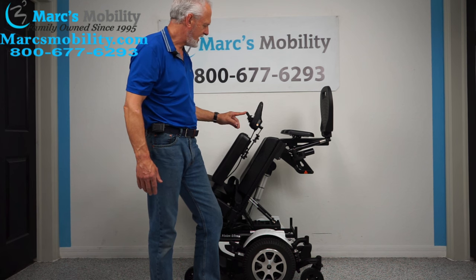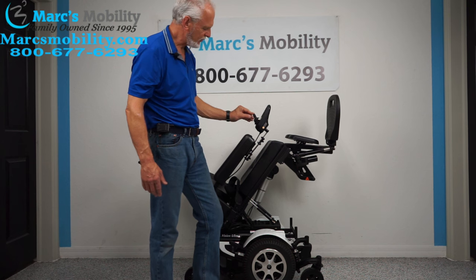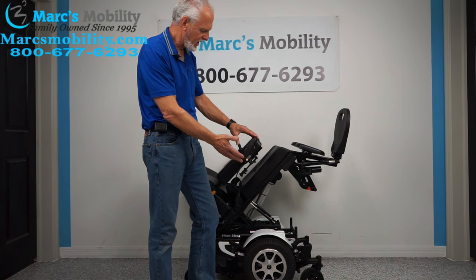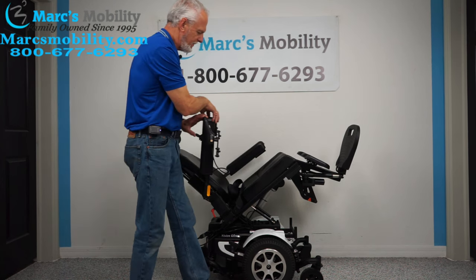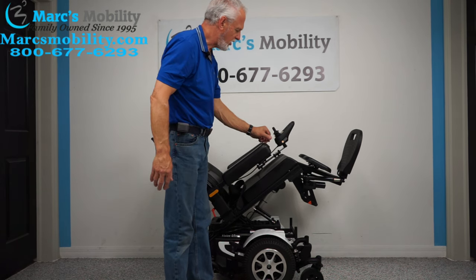I'm going to bring the seat back down. It's a slow tilt. This is called a swing-away joystick. If you're right-handed, it's already set up for the right. We can switch everything to the left if you're left-handed — the joystick and the swing-away can go to the left. The arms do flip up, so if you want to transfer from the side, you can flip the arms up.